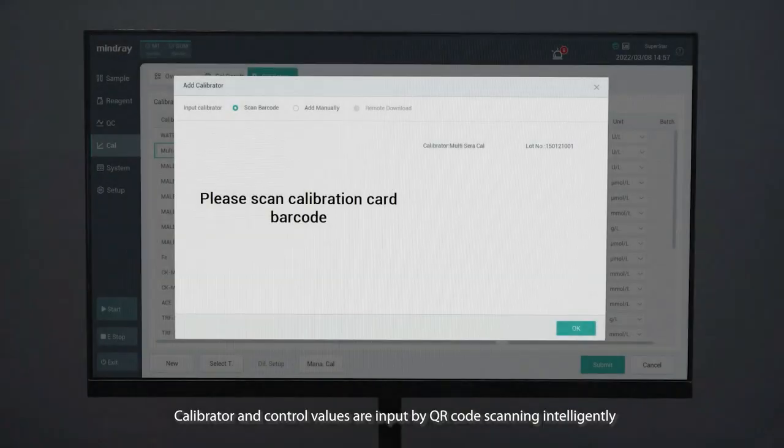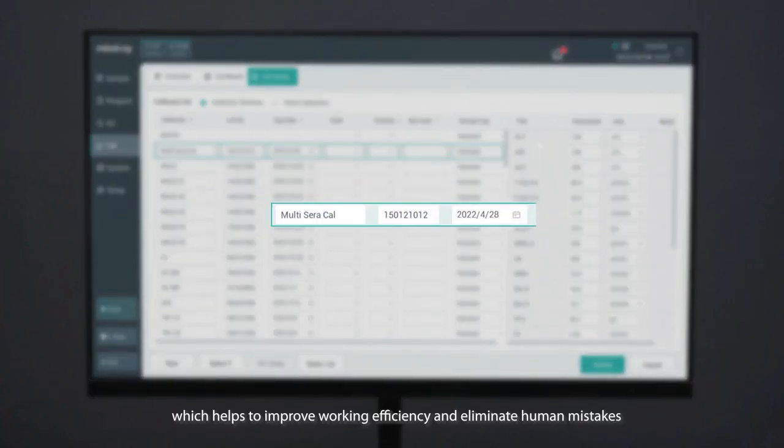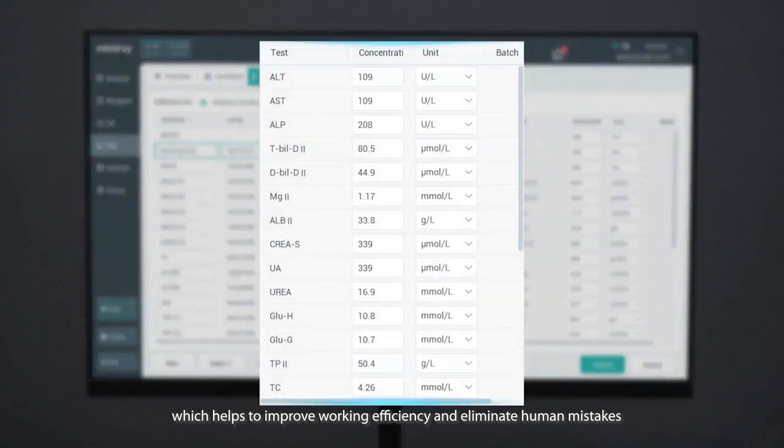Calibrator and control values are input by QR code scanning intelligently, which helps to improve work efficiency and eliminate human mistakes.